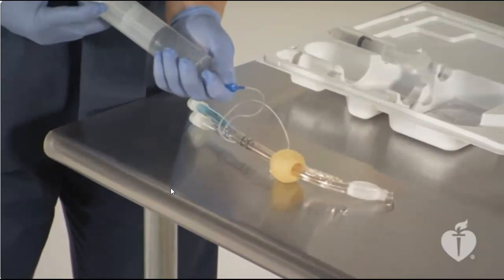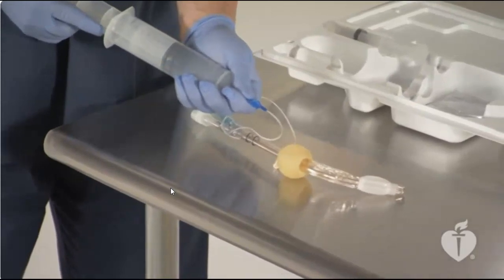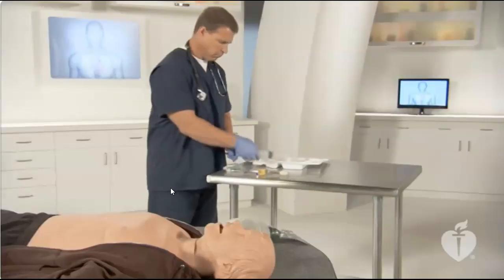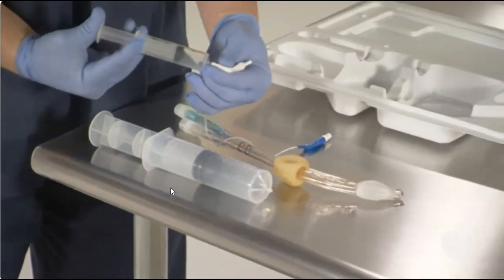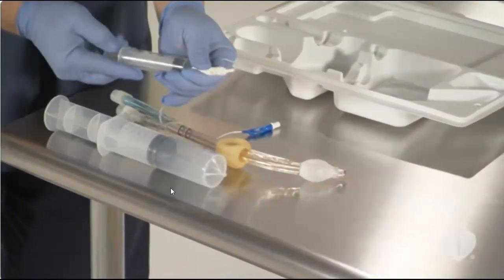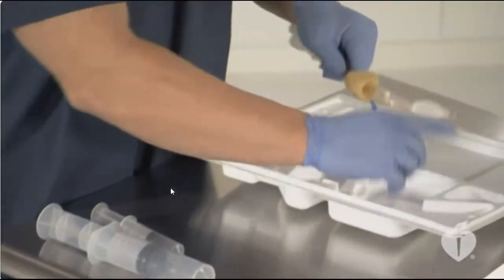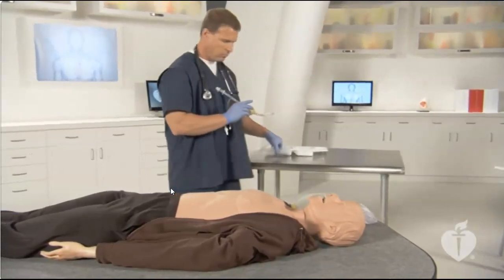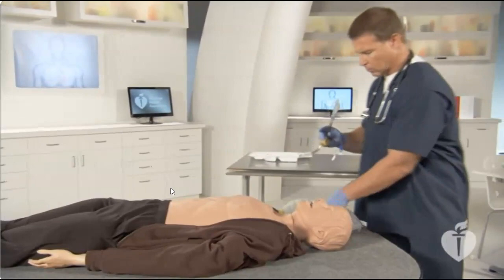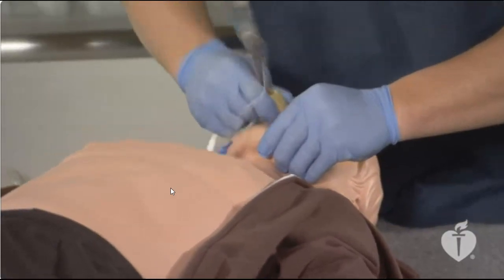To insert the esophageal tracheal tube, verify that the cuffs will hold air. The pharyngeal cuff, marked number 1, requires 100 milliliters of air. The distal cuff, marked number 2, requires 15 milliliters. Deflate the cuffs and lubricate with a water-soluble gel. Hold the esophageal tracheal tube in your dominant hand. With your other hand, grasp the tongue and jaw between the index finger and thumb and pull to fully open the mouth. As you insert the tube into the mouth, avoid catching the cuffs on the patient's teeth.